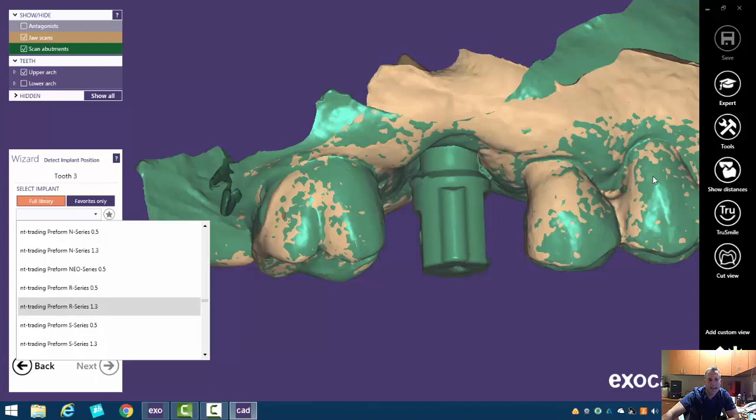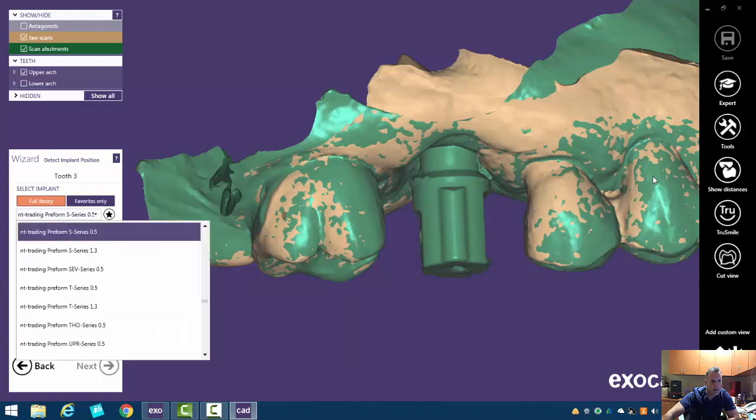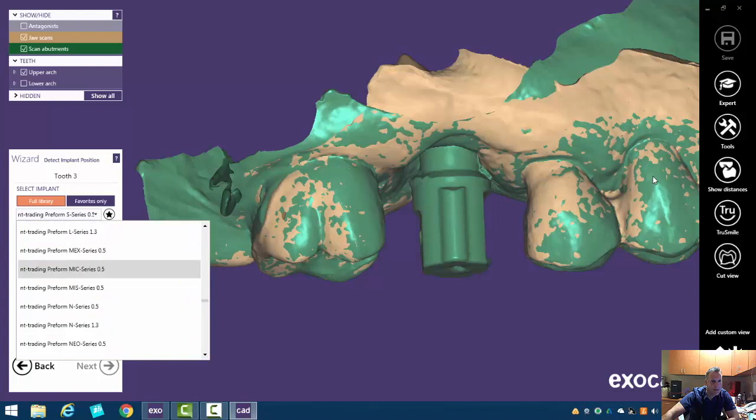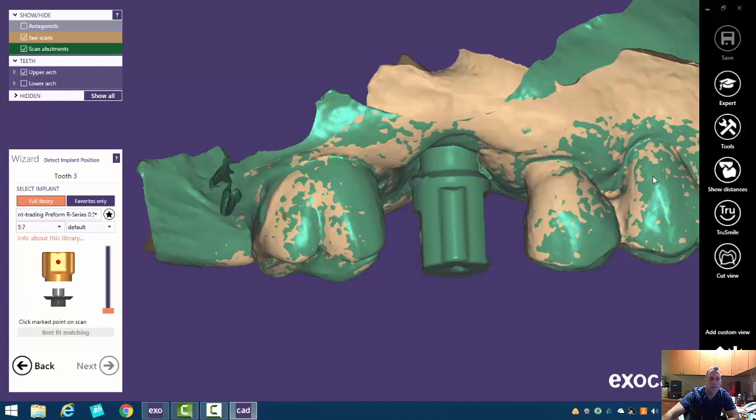There's two lengths, a 1.3 or a 0.5. We're going to select the 0.5, that's the shorter, and select 4.7. Actually, I selected that wrong. Sorry about that guys. R series 0.5 and 5.7 is our implant platform.